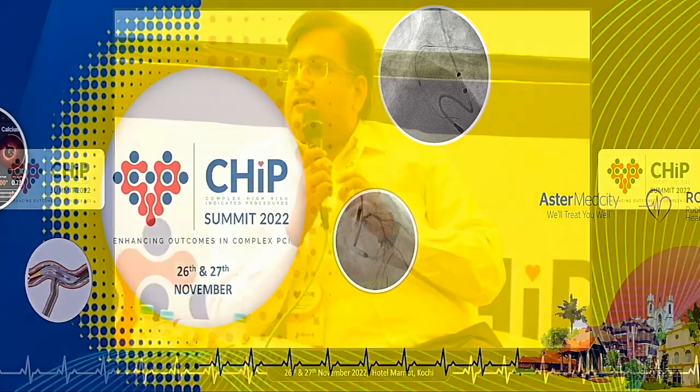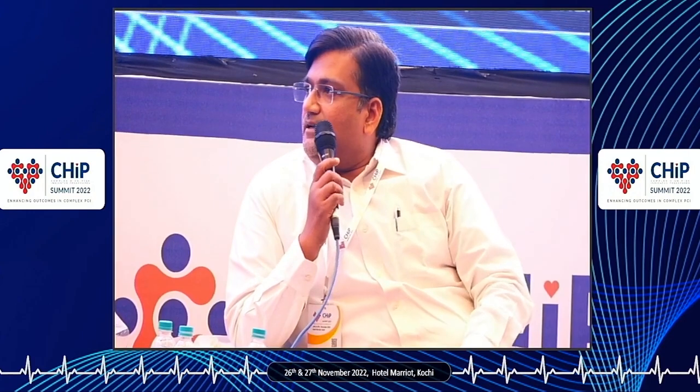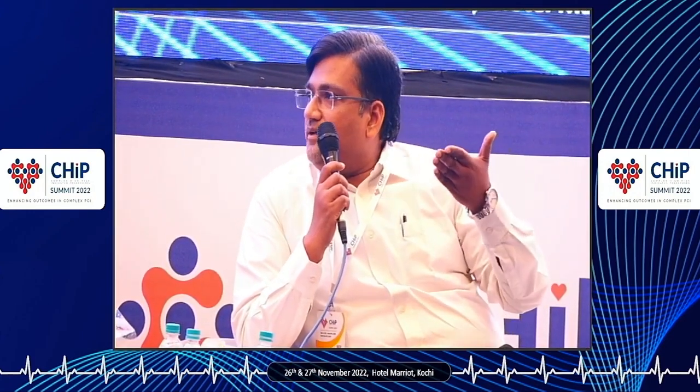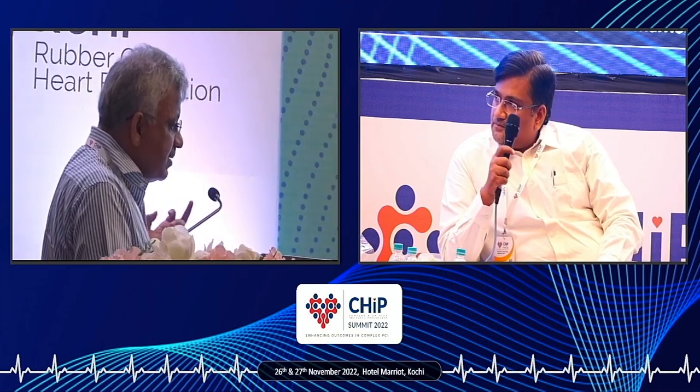Just for the sake of discussion, you started off with a tapered stent. Now we have stents available which can go safely from 3 to 4.5 millimeter, very new stents. So in that context, is it still a viable option to have a tapering balloon stent? Yeah, it is good when you have a 3 and a 3.5. When you have a 3 and a 2.25, it becomes an issue. When the difference is significantly massive, then it becomes an issue. Otherwise, you can post-dilate and go ahead, no issues.